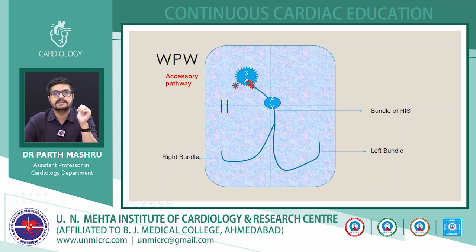But now the issue is that there is no conduction system present in the ventricles over here. So the action potential traverses through muscle-to-muscle conduction in the ventricles, and therefore there will be a wider QRS. At the beginning the QRS will be wider, but then the normal conduction from the AV node also excites the ventricle through the normal conduction pathway and reaches up to the area activated through the accessory pathway, leading to slurring of the initial QRS followed by a normal QRS. So this is basically what pre-excitation means.